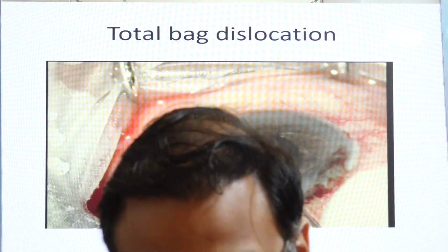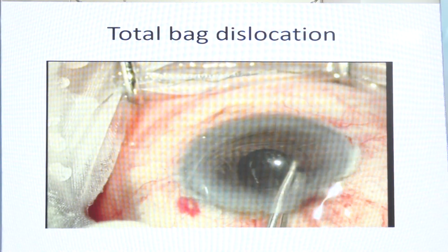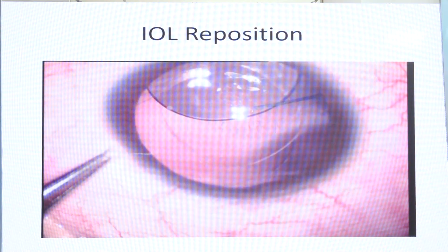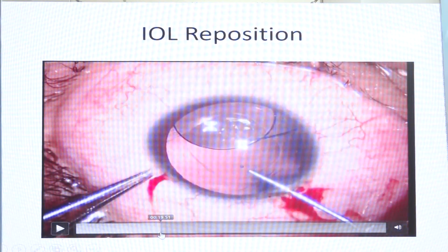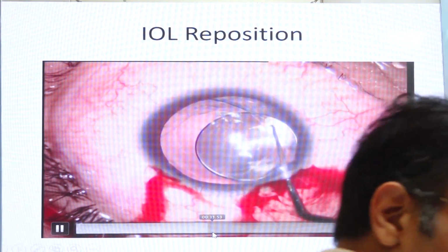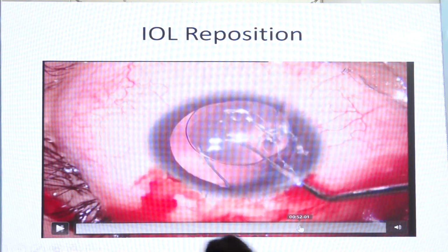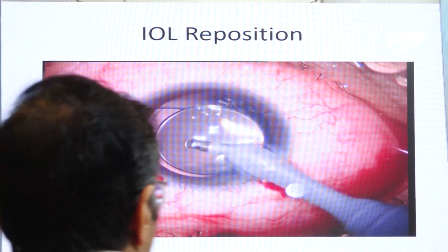So you should assess that the enclavation is good, and this type of lens will help you with security. Holding it at this junction will help. Then repositioning, because the support was good. Capturing, because this three-piece lens was in the anterior chamber, and just dialing it properly will help. So assessing your lens location after completing the surgery will help.